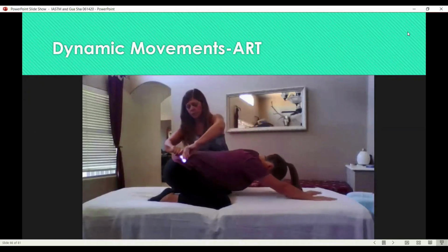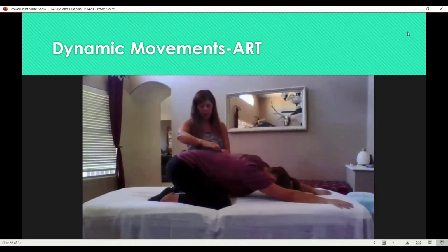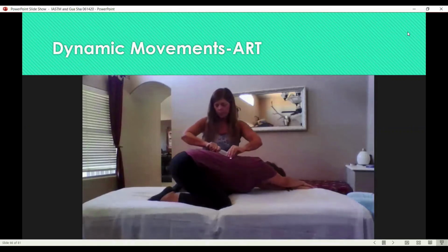So here she is just bending at the waist and stretching out those tissues. And I'm just showing over the clothes what options you would have. Here she's crawling her hands to the side. So we work on the lat attachments, obliques, quadratus lumborum. Right, it's kind of getting into child's pose and then tilting sideways, and we get some of those rotary attachments.